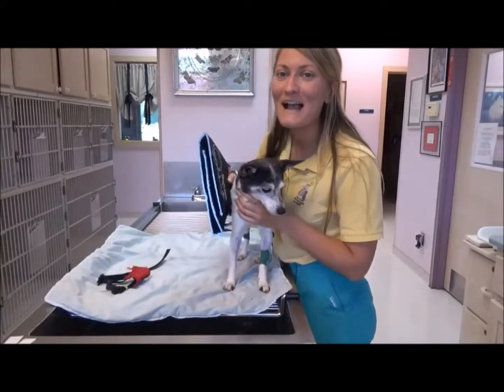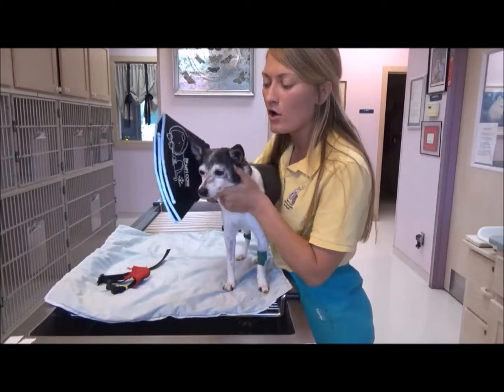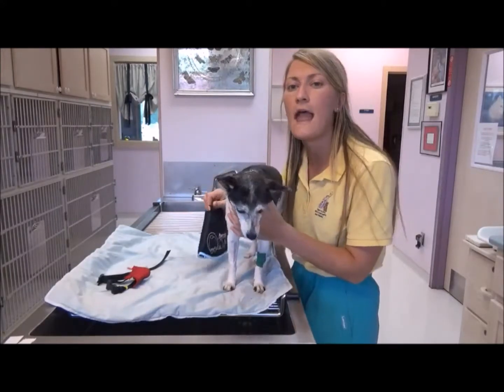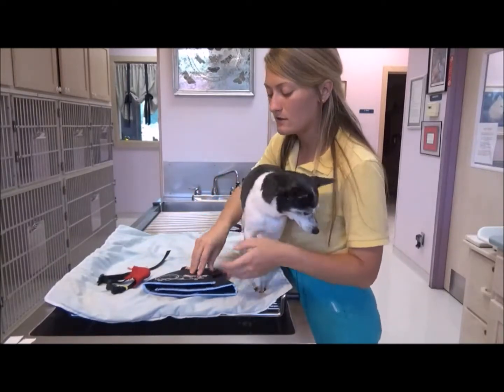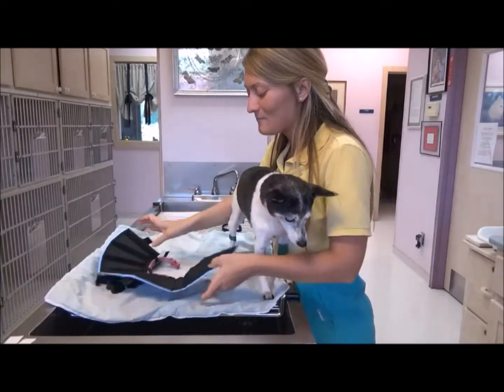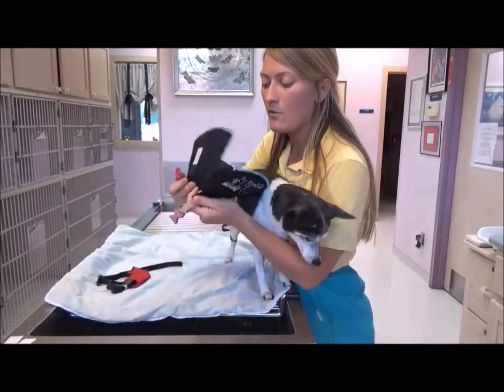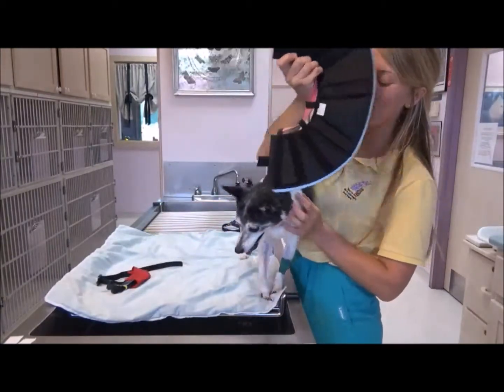For an Elizabethan collar, when choosing an appropriately sized one, you want to make sure that it's long enough that it prevents them from being able to reach any problem or incision area they have. You want to make sure that it fits snugly enough around the neck so that they can't just paw it off or simply get it off. Another key point is that you always want to run a collar through the loops on the Elizabethan collar. That way you can be sure that the Elizabethan collar fits snugly on them.